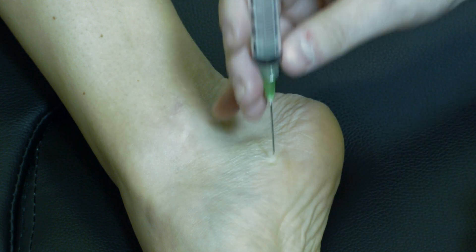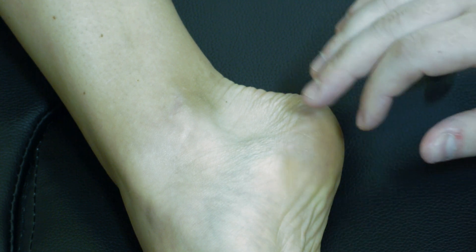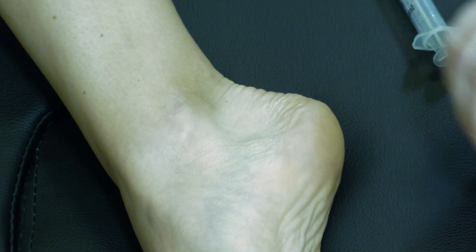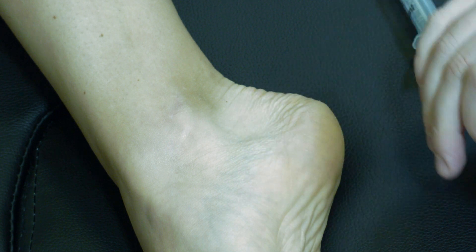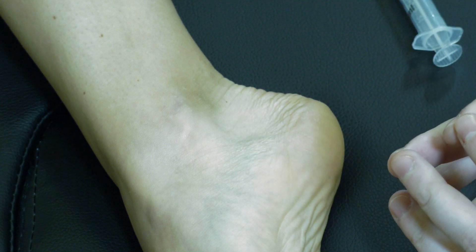We prefer this medial technique over going through the plantar skin because it keeps us deep to the plantar fascia, resulting in less spread of injectate into the calcaneal fat pad — which, if using steroid, could cause fat necrosis or fat atrophy.